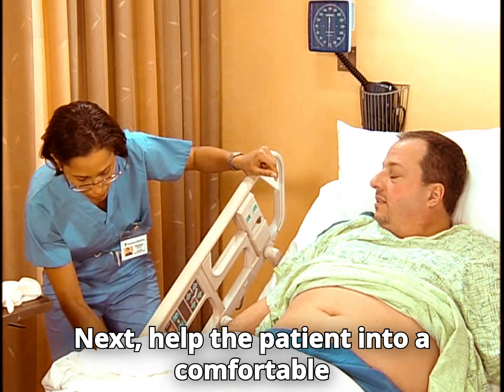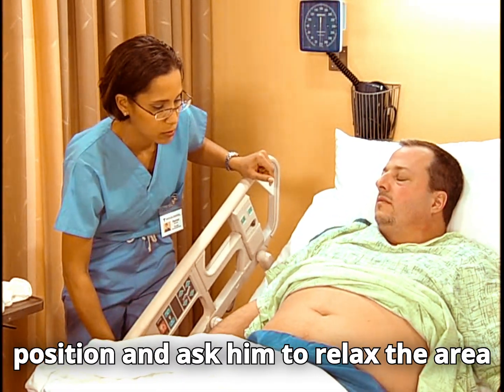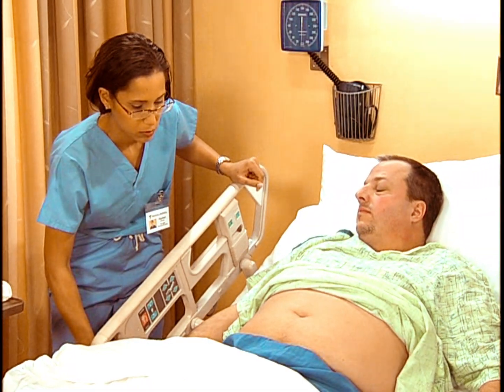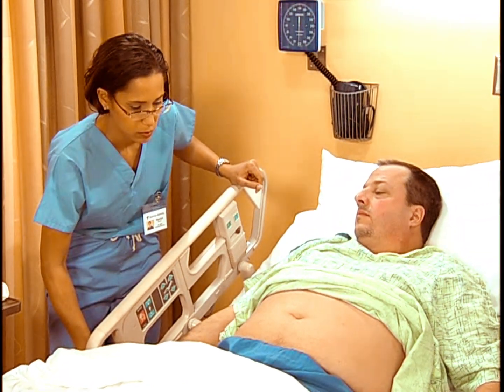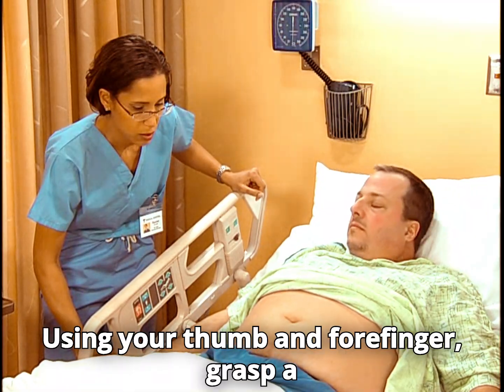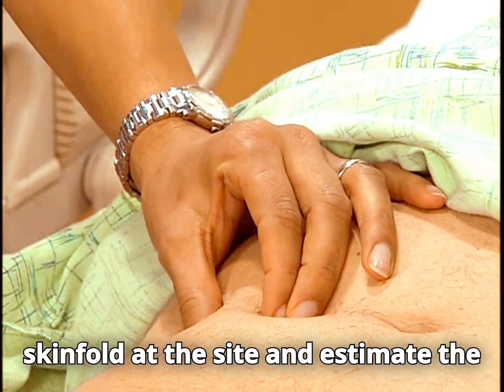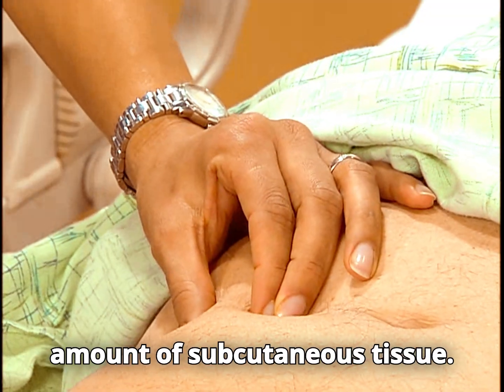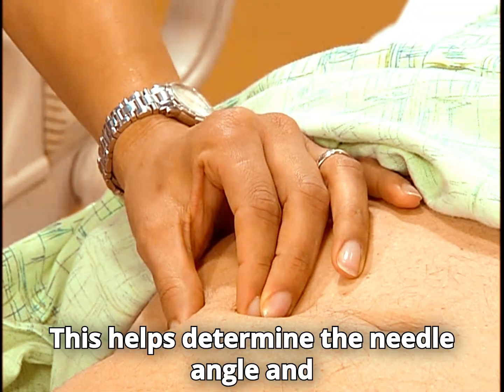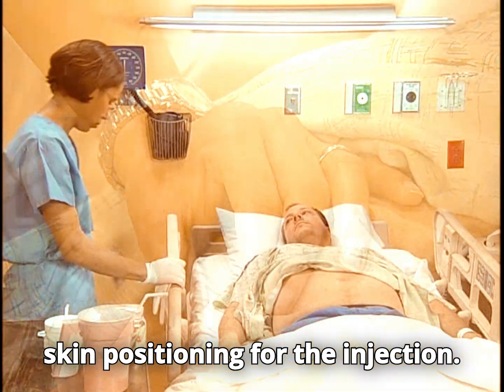Next, help the patient into a comfortable position and ask him to relax the area chosen for the injection. Using your thumb and forefinger, grasp a skin fold at the site and estimate the amount of subcutaneous tissue. This helps determine the needle angle and skin positioning for the injection.